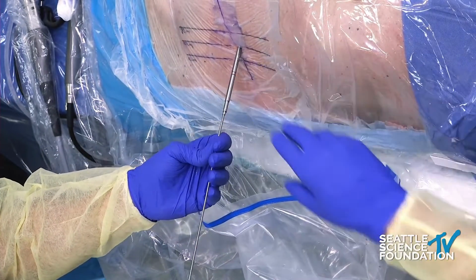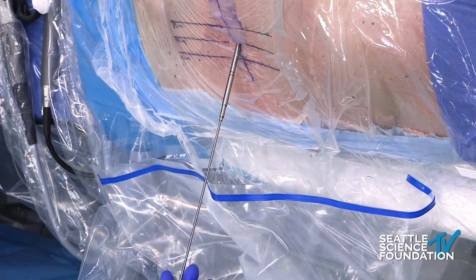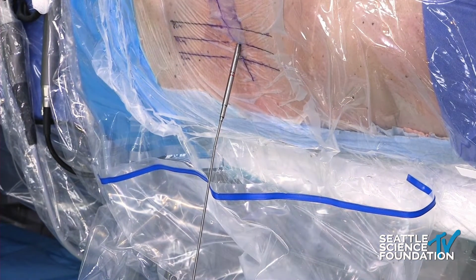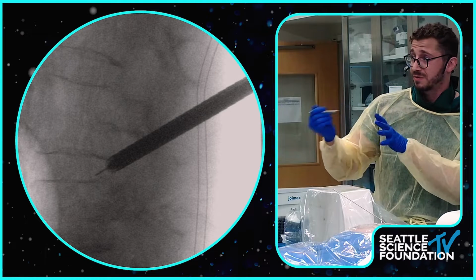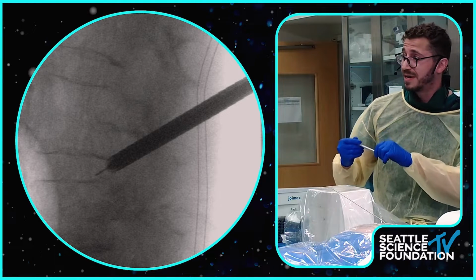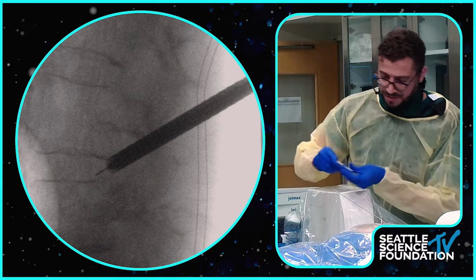Okay, awesome. All right, so now can you show us a lateral, please? Okay, so it looks great. So I'm going to put the working channel in. Do you want to do the approaches for both and then put the scope in for both? Or maybe we can just keep going all the way? Okay, cool.